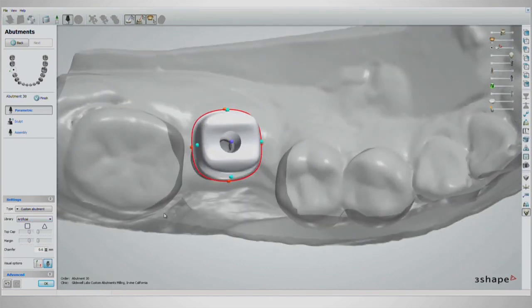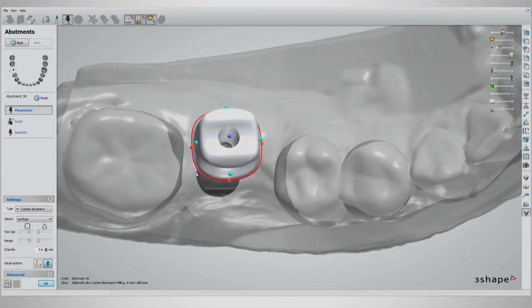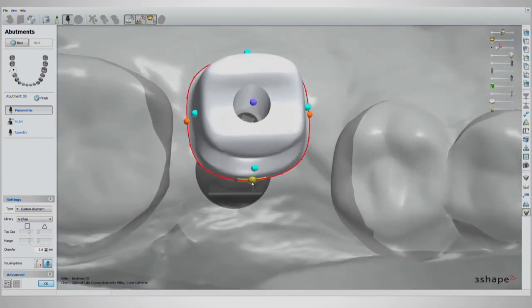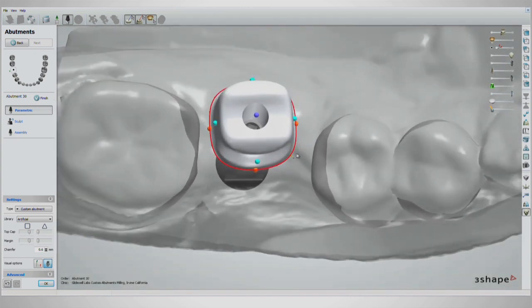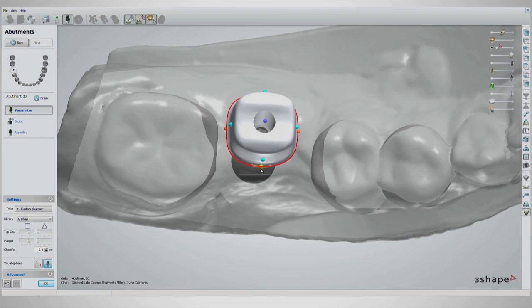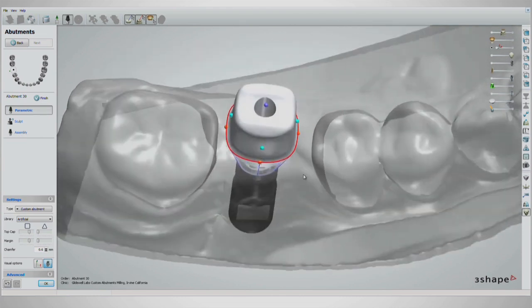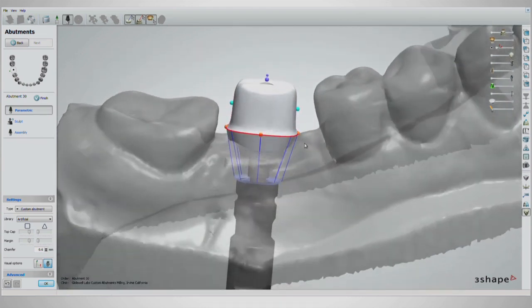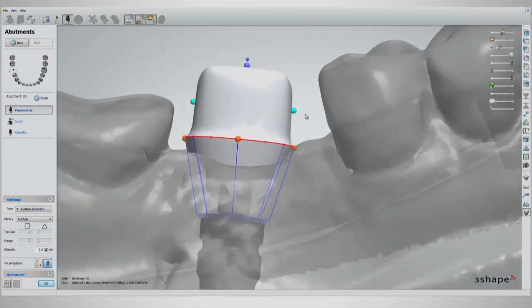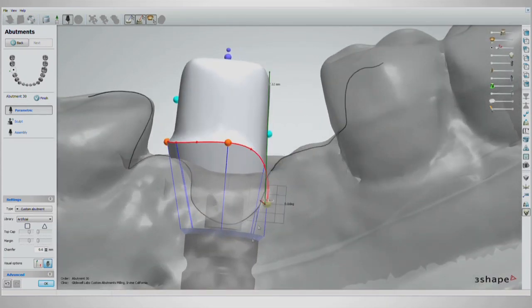Now from the occlusal view, the abutment can be adjusted by clicking and dragging on the orange, purple, and blue spherical handles. From the occlusal view, dragging the orange handles allows you to rotate the abutment. After the rotation is correct, move to a buccal view.